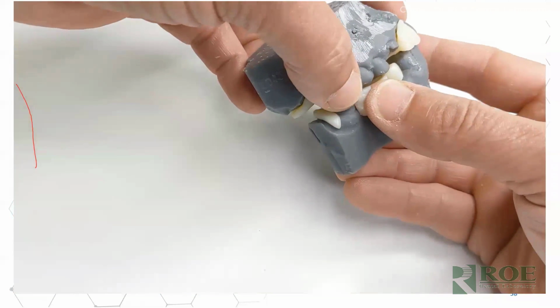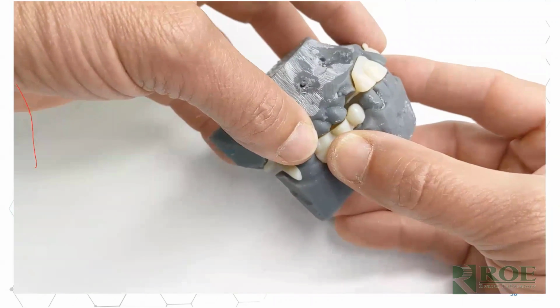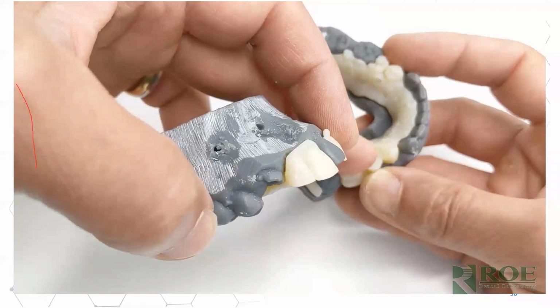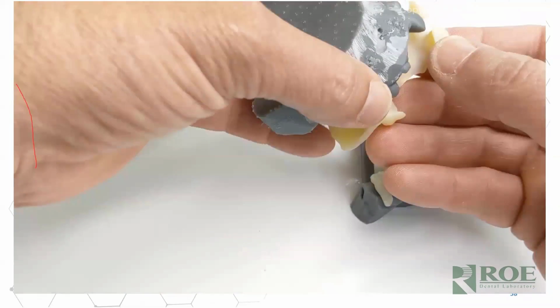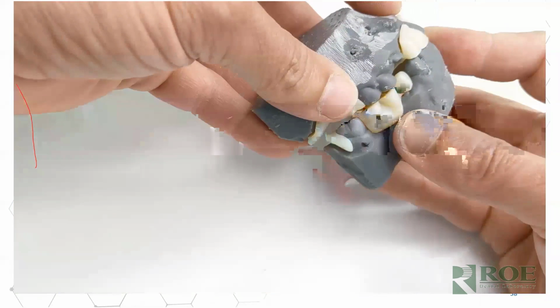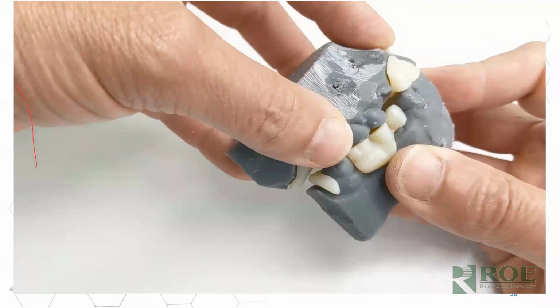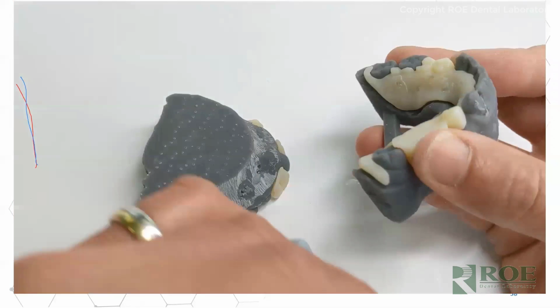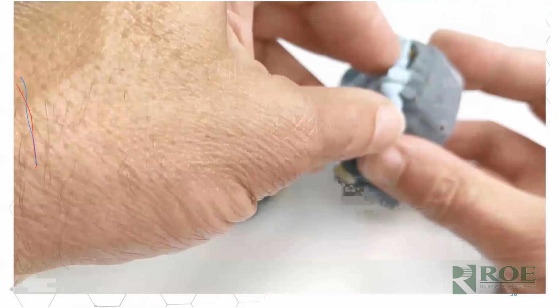And when we send them out, I believe that the case was a little bit opened, and the doctor just adjusted it down. You can see there's adjustment marks here, and there's adjustment marks on the maxillary. So once the bite is equilibrated down to just where the doctor wants it, just where it's ideal in the mouth, then a bite registration is captured between the 2.